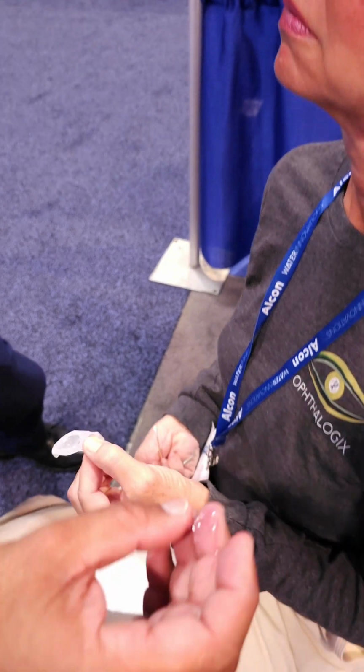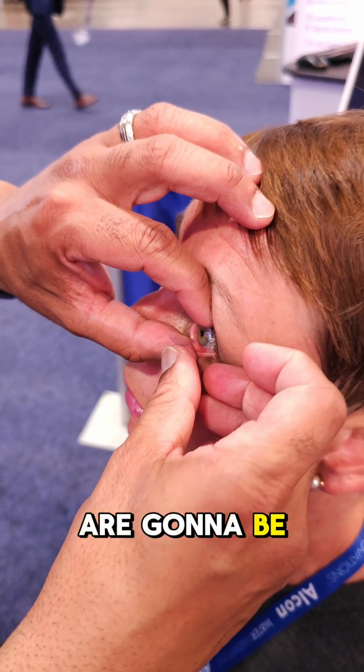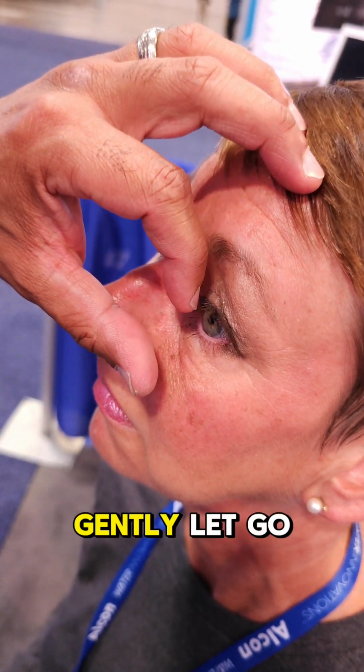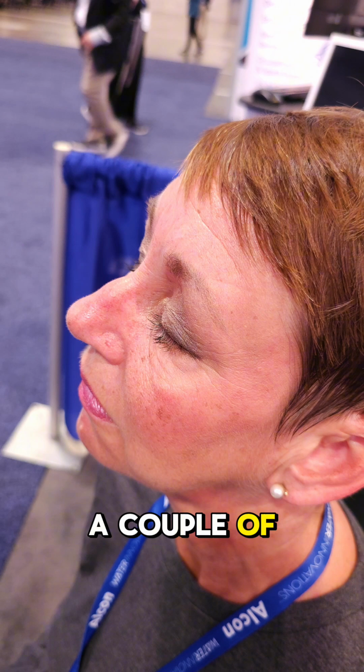Great. And now, because I'm in front of her, just the ergonomics of using my thumb are going to be easiest to put my bandage lens on. I'm sorry I'm blocking your view, guys, I apologize, but it's on. So now I'm going to let go of the bottom lid, gently let go of the top lid. She's going to kindly close her eyes. She can move her eyes left and right a couple of times to massage out any air bubble that might be trapped there, and eyes open.